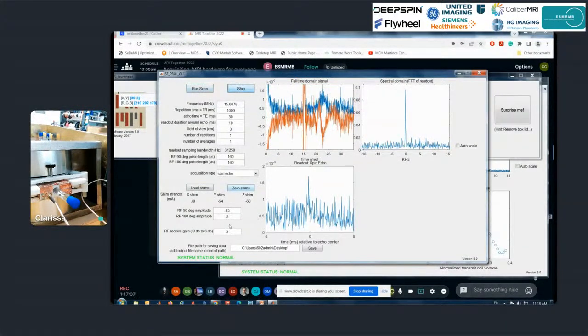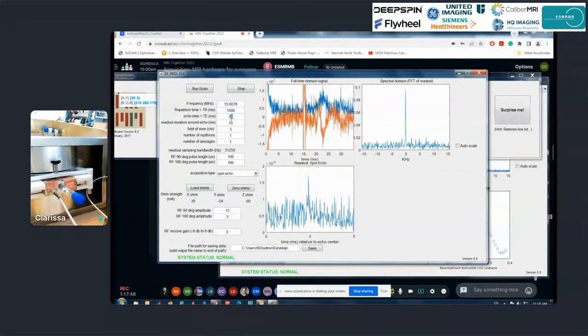The 2-tube phantom. Okay, this is a different phantom, so that's why the signal looks lower. One thing we can do in this GUI is the students can change the echo time so they can see how the T2 decay changes. Do you want to actually put the other phantom in just so we can see the signal a little bit better first?